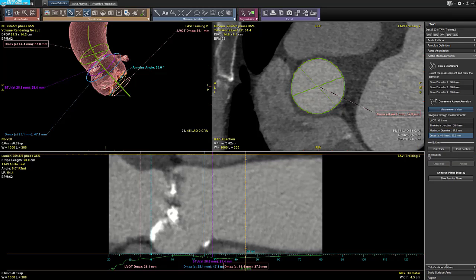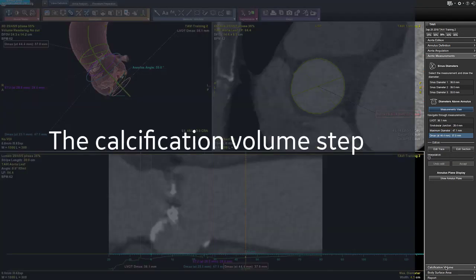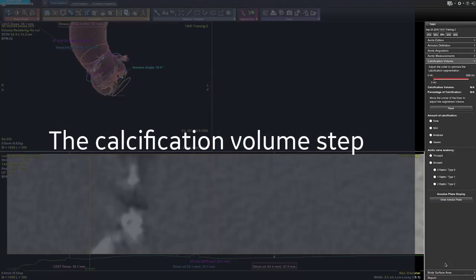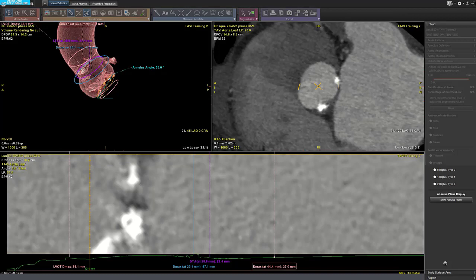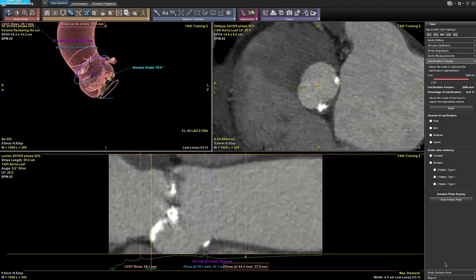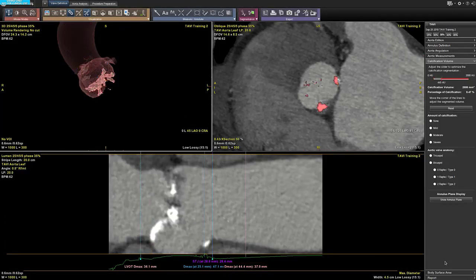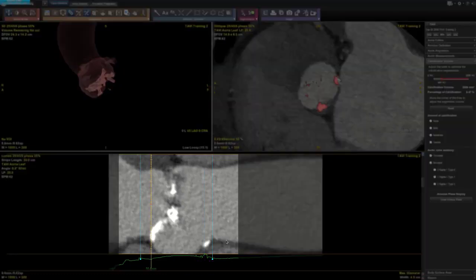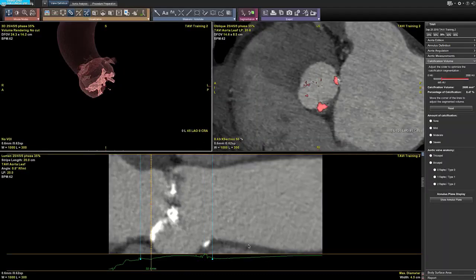We can go to the calcification volume step. In this step you can obtain the quantification of the calcification around the aortic valve. It shows the calcification volume and the percentage of calcification between the two blue lines on the lumen view. The percentage of calcification is calculated by comparing the volume of calcification with the volume of the vessels.